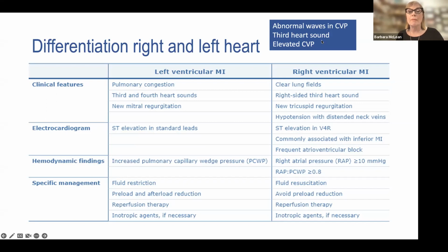So number one, elevated CVP, my friends, do not assume that an elevated CVP means your patient has too much volume. He may have high volume load in his veins, he may have high volume load in his interstitium, but CVP typically above 10 indicates loss of right-sided compliance. And that means pulmonary vessel, pulmonic valve, right ventricle, tricuspid valve, right atria.